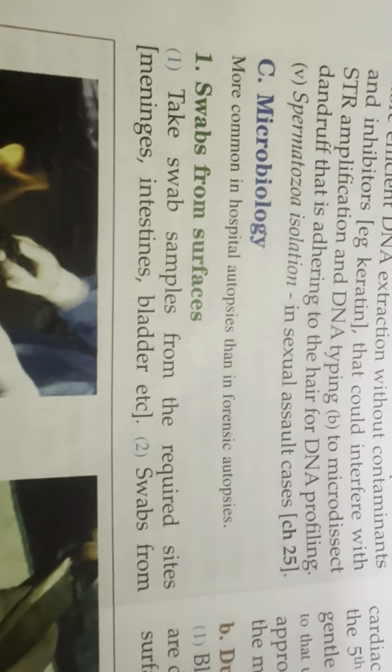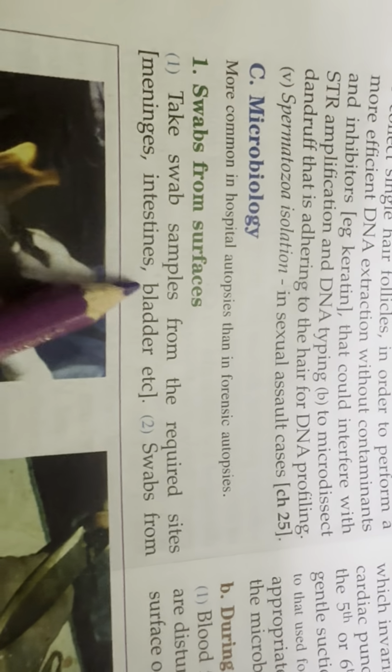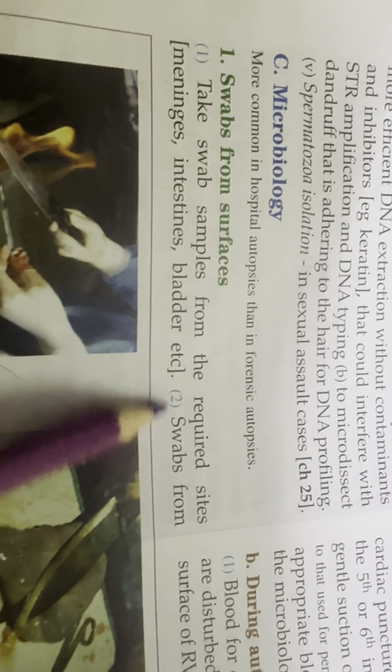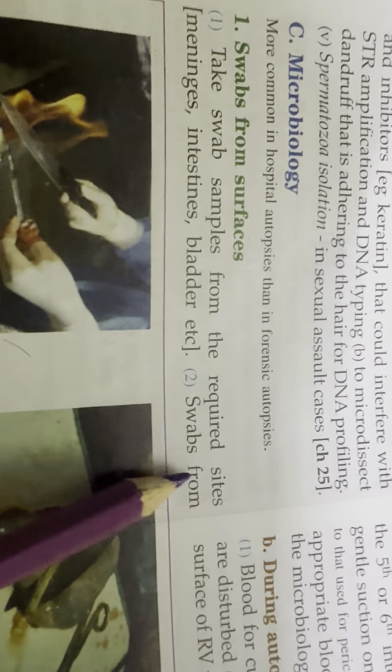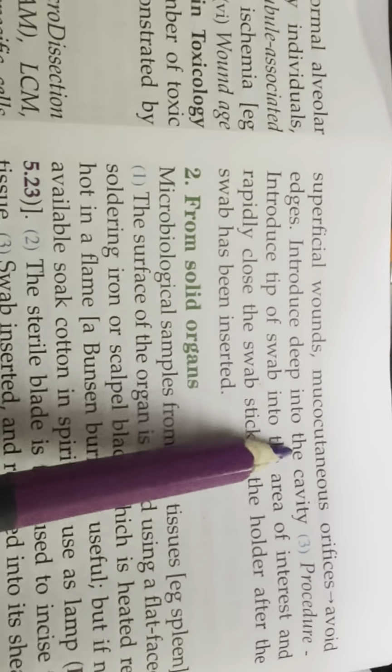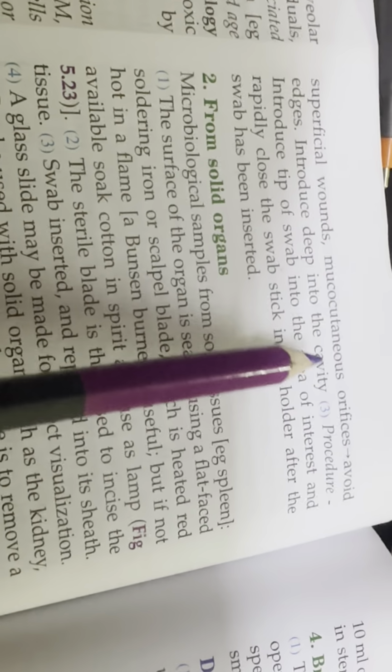Microbiology is more common in hospital autopsies than in forensic autopsies. Swab from surfaces. Take a swab of samples from the required site: meninges, intestine, bladder. Swabs from a superficial wound or mucocutaneous orifices, avoiding the edges. Introduce the swab deep into the cavity.